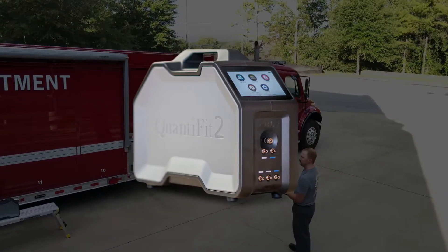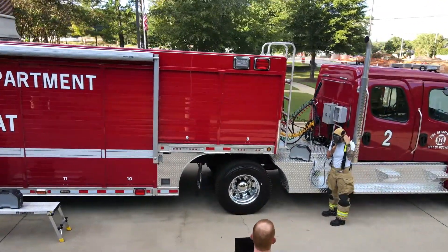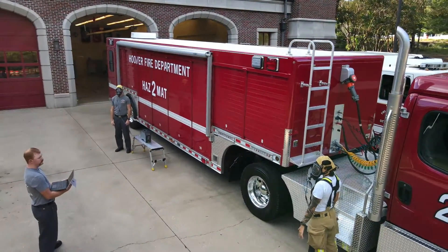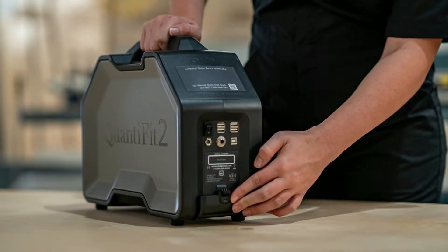Introducing the revolutionary Quantifit 2, disrupting the fit testing industry as we know it and changing the way we fit test elastomeric respirators. Now with optional battery packs, the Quantifit 2 allows you to fit test virtually anywhere, including outside.